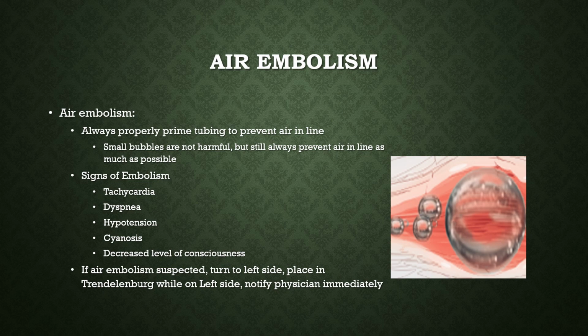Air embolism is when air gets in the tubing. You've all seen movies where they were murdering somebody by injecting air into their tubing and killing the patient. That was always the way to commit murder, especially on a soap opera. That's very hard to do.